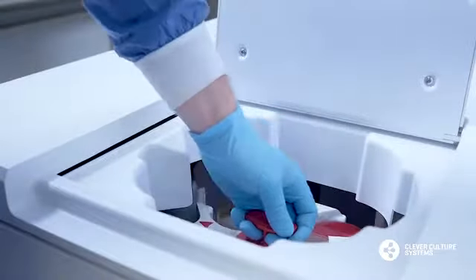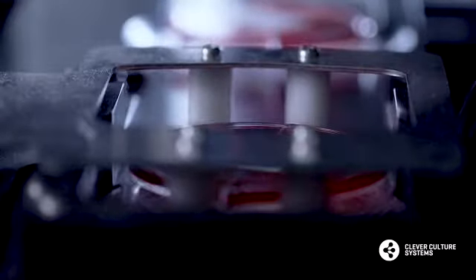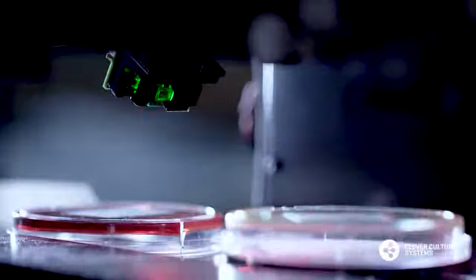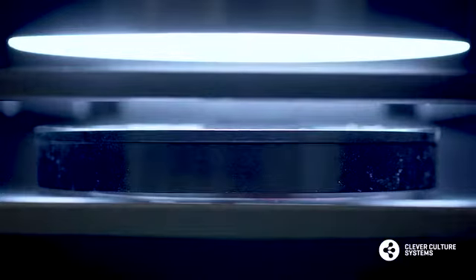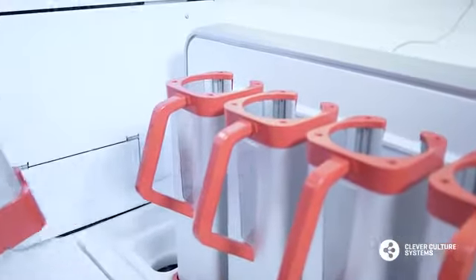As a plate enters the instrument through the carriers, the plate is then processed via the imaging station. An image is taken of the plate, it's analysed in about 4 to 6 seconds. An assessment of the significance of the growth on that plate is made in that time. The plate is then given a designation of whether it's actually significant or not, and then it's moved through the instrument into the appropriate area.